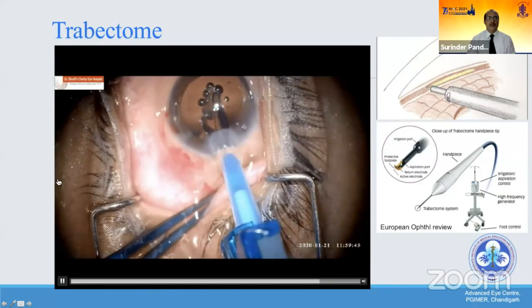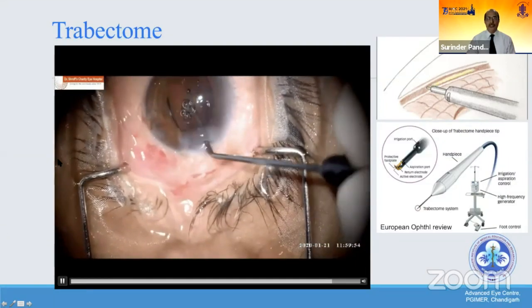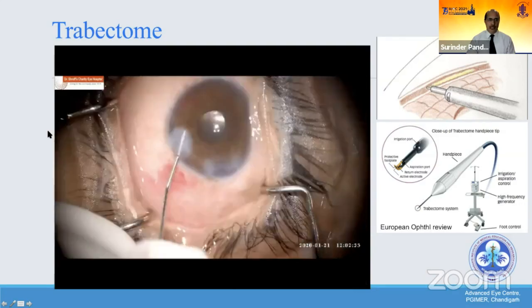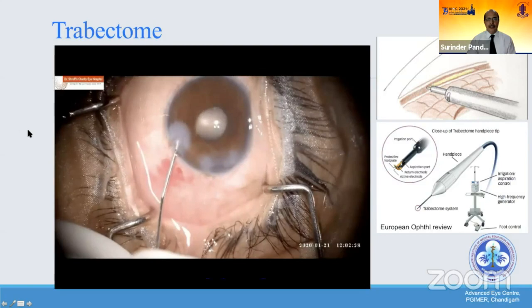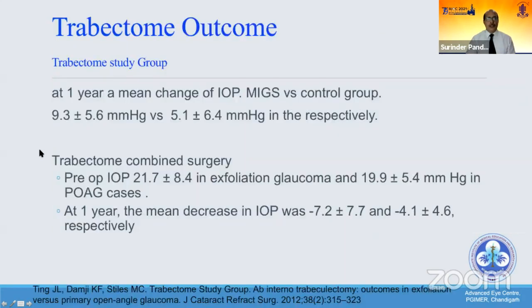Basically, the procedure is quite simple and straightforward in that sense, but it needs expertise with gonioscopy and also has a learning curve. At the end of the surgery, you can just hydrate the ports, and that basically takes care of it.